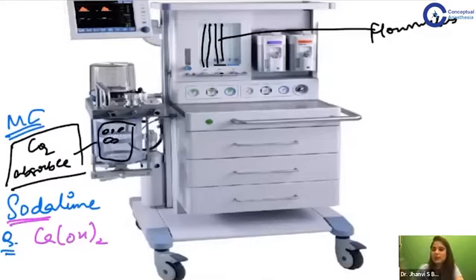Okay, so these are the important things that you need to know about the machine. From the front, you should be able to identify the vaporizer, the flow meter, and the carbon dioxide absorber. At the back of the machine, we will have cylinders. We will discuss the cylinders and the pipelines and their color coding ahead.